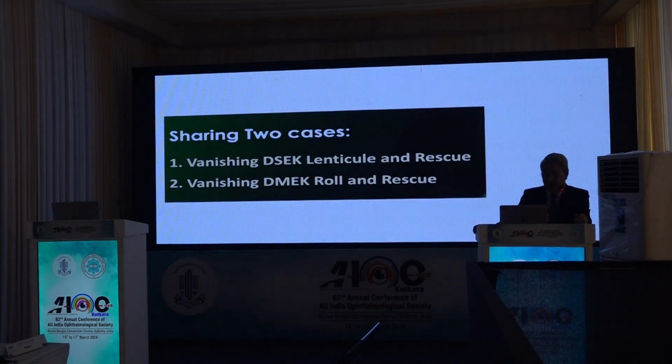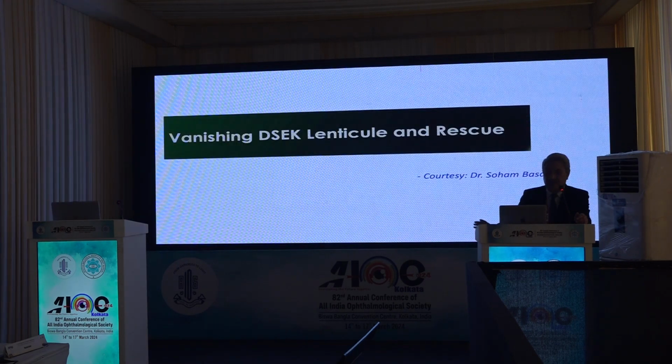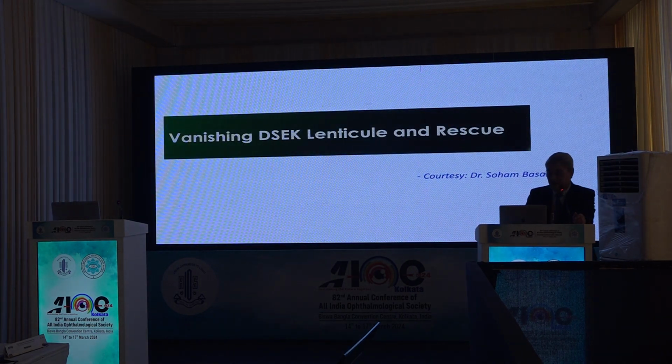So I'll share two cases. One is a vanishing DSEK lenticule and rescue, and the second was a vanishing DMEK roll and rescue. The first was done by Soham, and you cannot redo it. It just happened, and the rescue happened accidentally.